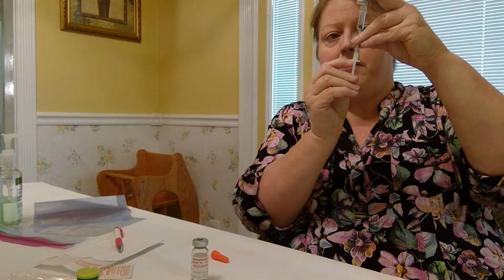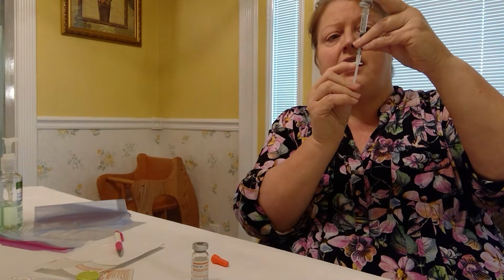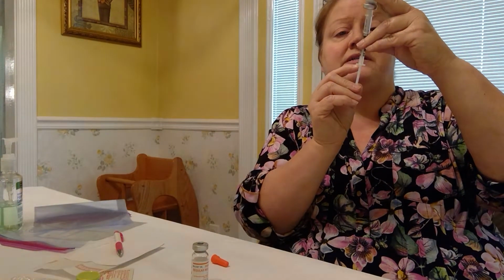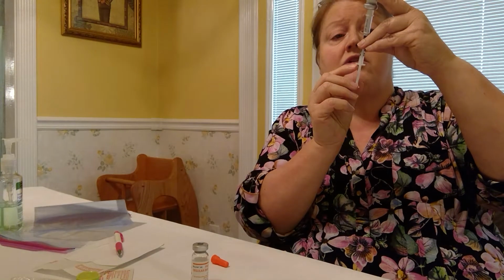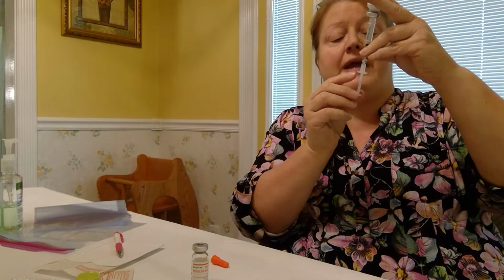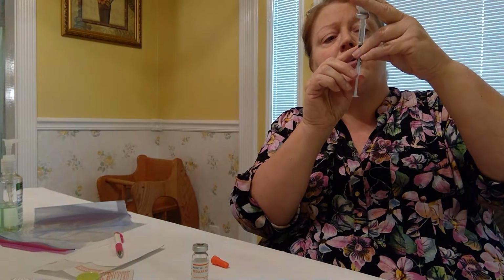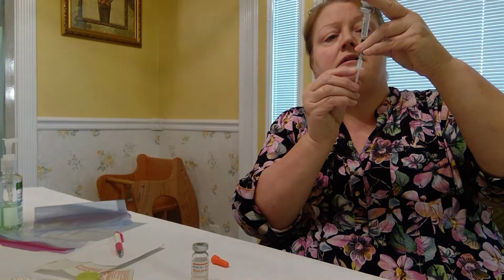If you get an air bubble in this, you will have to start all over because you do not know how much is in and how much of R that you've messed up. So there's no way to push any out. You would have to totally start over. If you pull back too far, there's no way to push back into this. You would have to start totally over. So be very slow and methodical in it. 40, 42, 44, 46, 48.